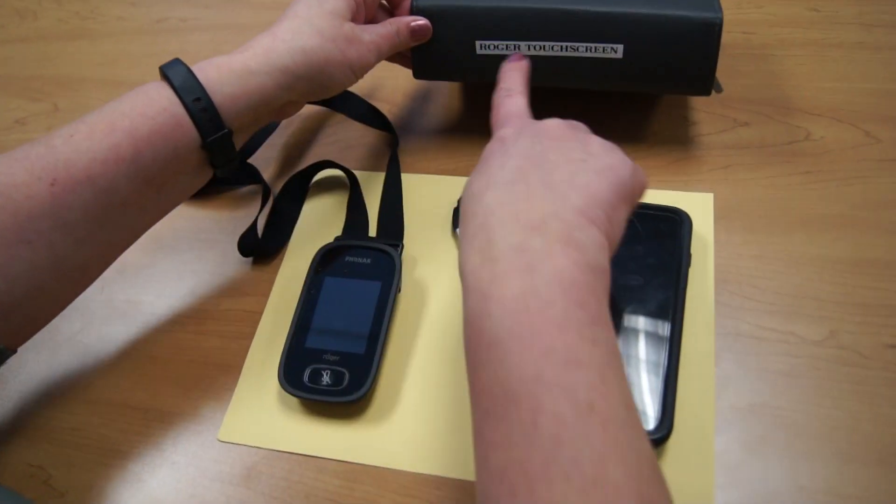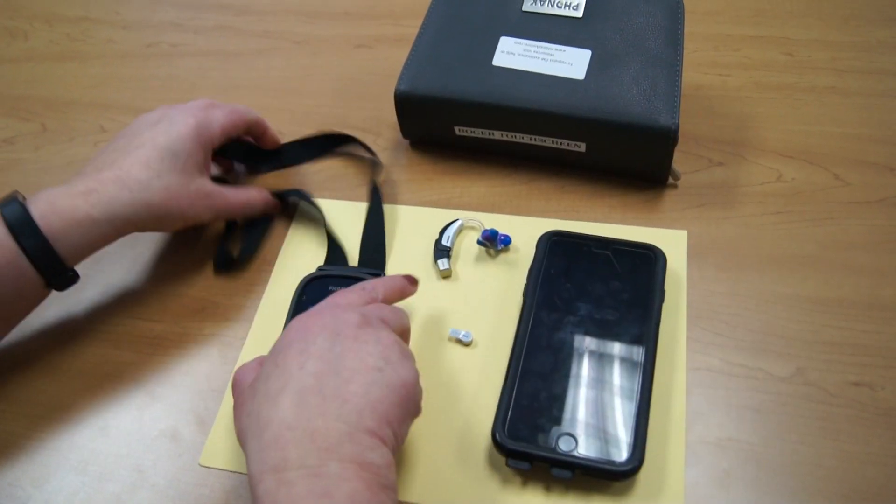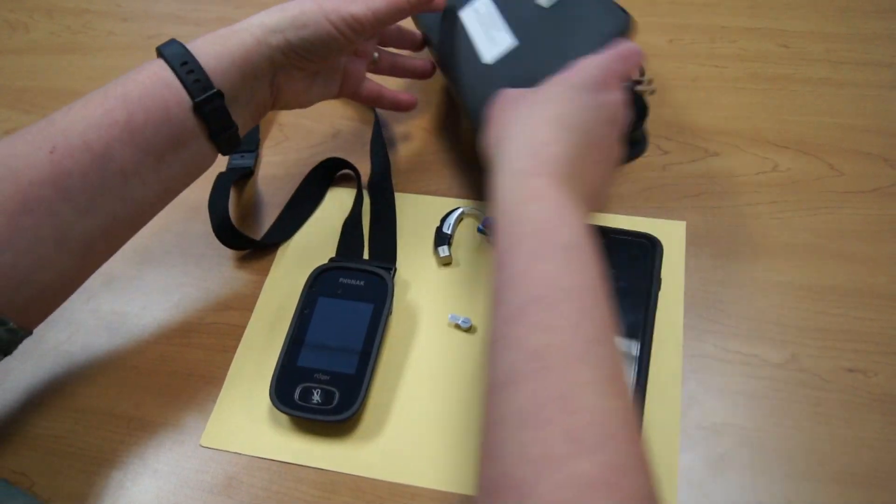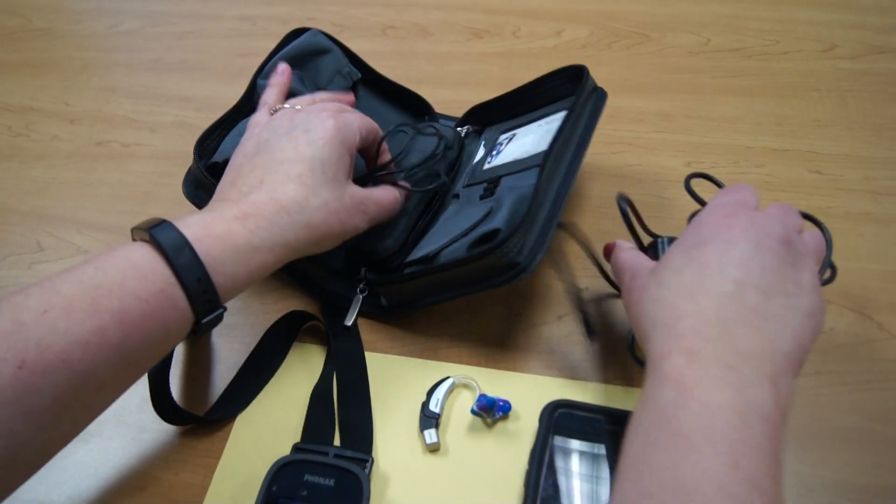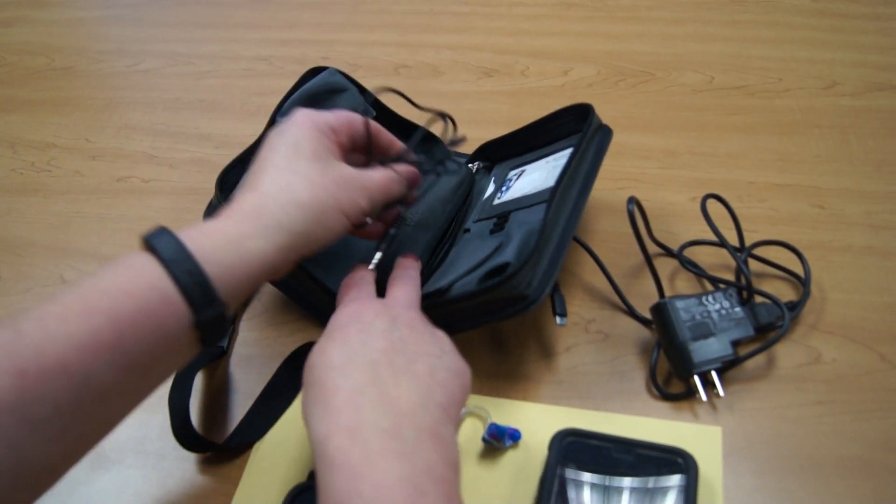In this video, we'll be doing the training of the Roger touchscreen. In your case, you'll have your transmitter, your charger, and in the center, your audio cord.